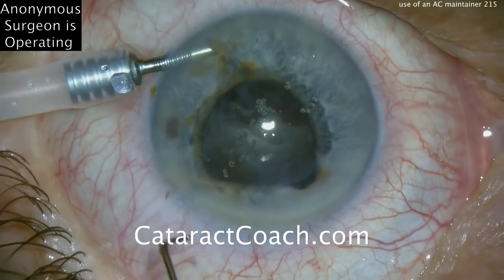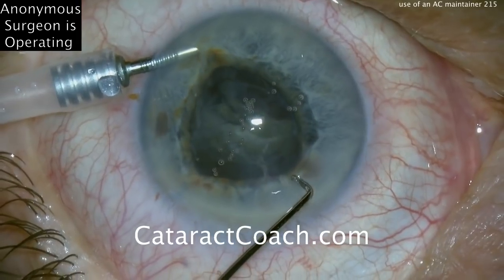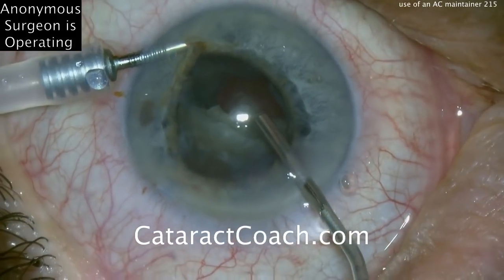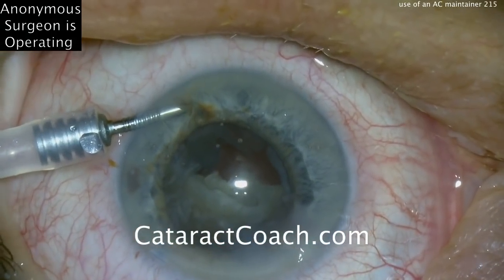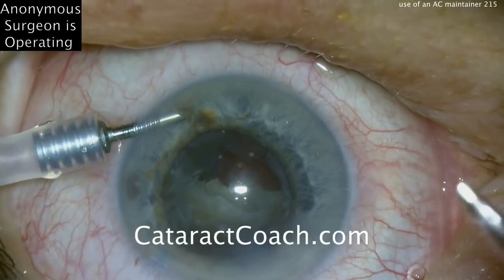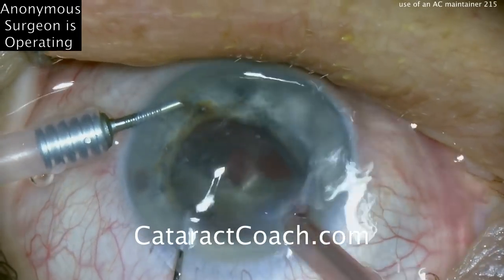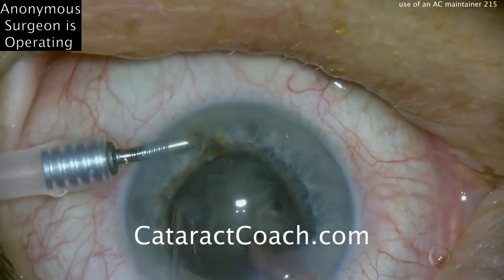About half of the nucleus has been removed from the eye. A chopper is being placed inside. Now maybe the AC maintainer is off at this point — there's viscoelastic going in. It's very important to get enough viscoelastic inside the eye. Sometimes the anterior chamber maintainer can also push away your viscoelastic, so you have to be careful, especially if it's aimed towards the endothelium. This anterior chamber maintainer has grooves on the tip so that when you make a small incision, it's able to hold itself in position. One hemi-nucleus is remaining and is rotated around.